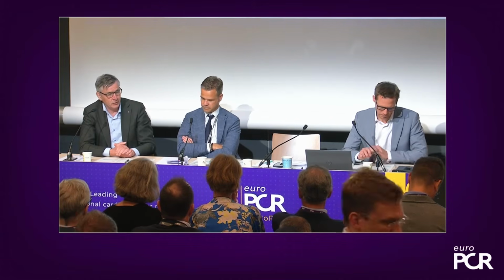And also, even though we're still in a learning phase, it may give us a better assessment of peri-device leak, which can be a little bit limited with the 2D probe. But I don't know whether you can comment on that, Martin.